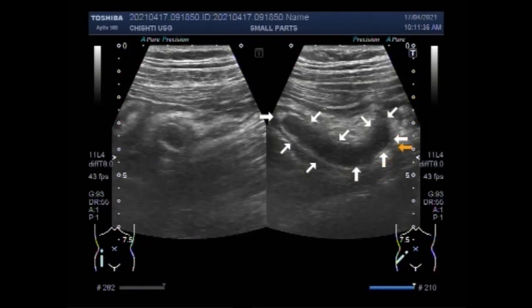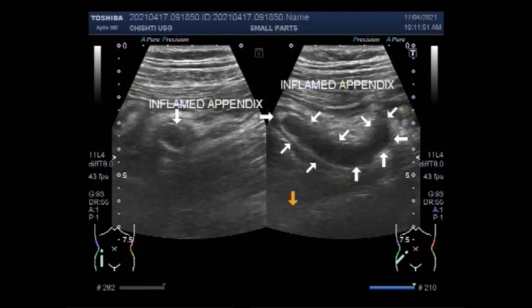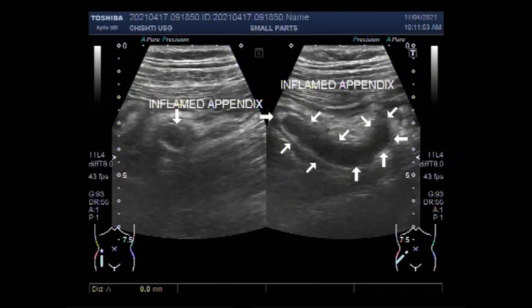But I personally think that in expert hands, the success ratio may be more than 50%. The video shows the localization of the inflamed appendix. A small amount of free fluid is seen in the lower abdomen in this case.